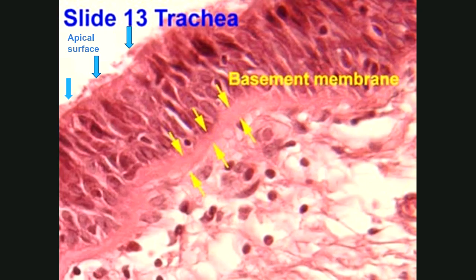So here's an epithelial tissue right here. Not this whole thing, but only from here to here. That's the epithelial tissue, not this over here. And the reason I know this is because epithelial tissues are surface tissues. And so there's always going to be a surface. So look, there's space out here, empty space. So this tissue is facing that space, and so it's on the surface.